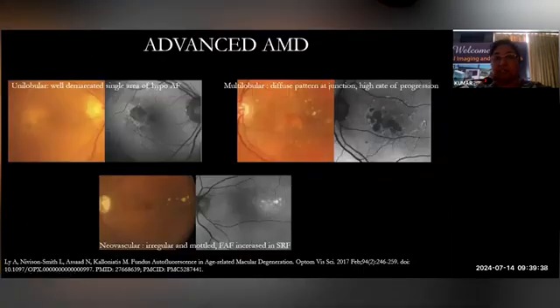In cases of advanced AMD or geographic atrophy, unilobular atrophies show a well-demarcated single area of hypoautofluorescence. A multilobular diffuse pattern is seen at the junction. These multilobular atrophies should be monitored closely because they have a very high rate of progression. The neovascular AMDs show irregular and mottled FAF, and the increased FAF corresponds to the increase in SRF.